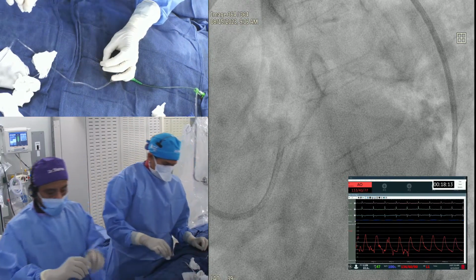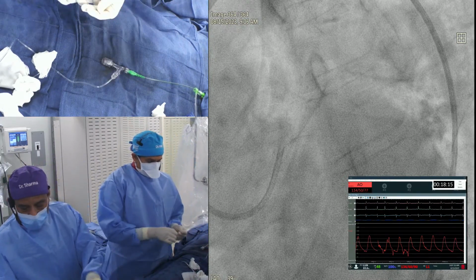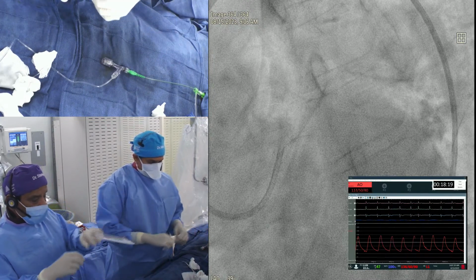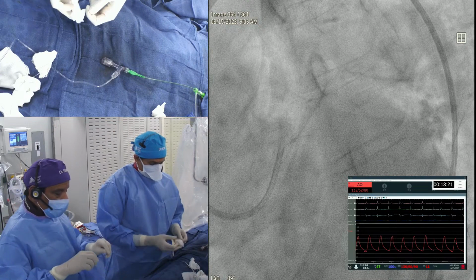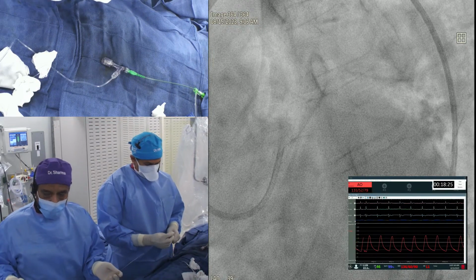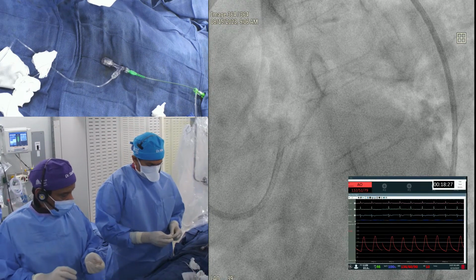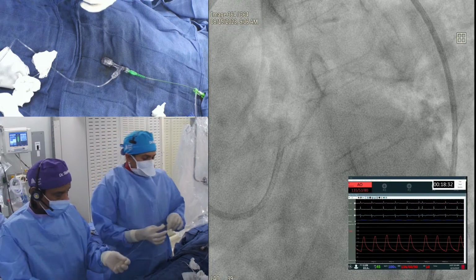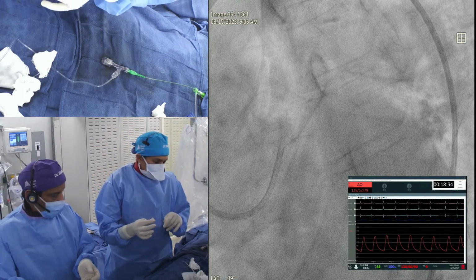But you saw another modification we did: atherectomy at low speed, which will be less traumatic. It is more of a dynaglide, between dynaglide and your regular speed. It goes slowly, and it did make the difference. I think pulling the guide back and making it more coaxial helped.